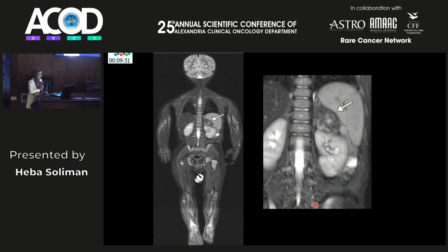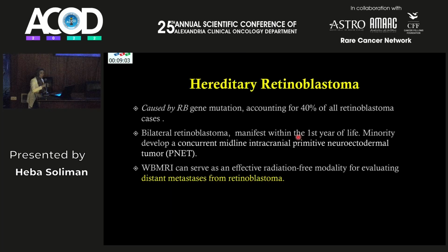This is a 2-year-old patient who was genetically known to have Li-Fraumeni syndrome, and he underwent whole body MRI for screening of a tumor that showed a small left adrenocortical carcinoma. And this was found just by screening by whole body MRI.